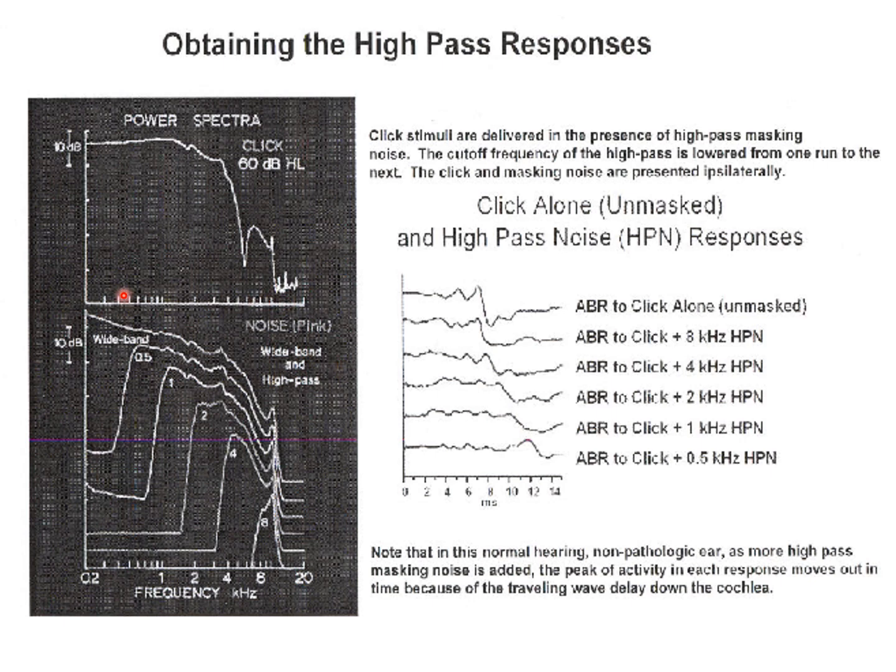The figure on the left shows the amplitude spectrum for the acoustic stimulus. The top panel shows the frequency spectrum for clicks. As you have already known, clicks are wide band frequency stimuli, so it contains a wide frequency band. And the panel on the bottom shows the amplitude spectra for those high-pass noise. Say if we set the cutoff frequency at 8,000 Hz, then only the high frequency portion will pass. So only this portion of noise will pass.